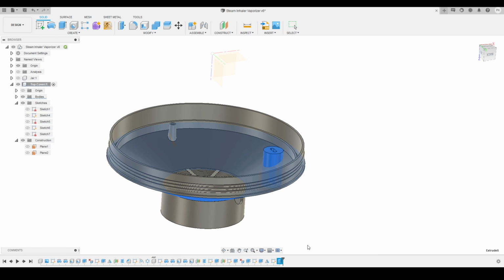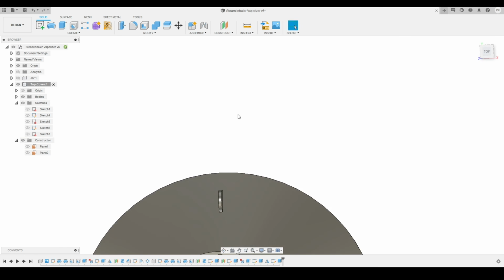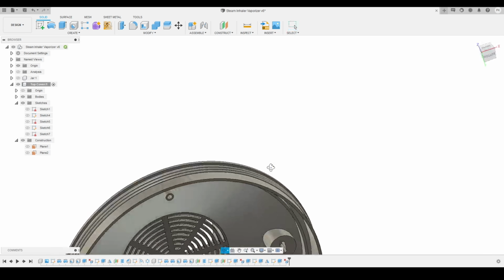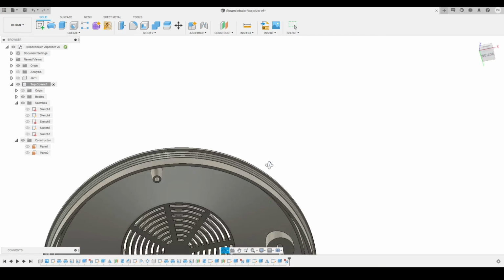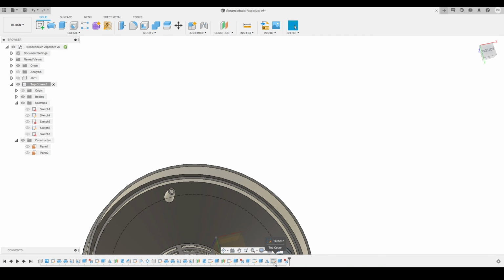So you can see this piece has been created as a new body, but I had just changed it back to a join body. Now I don't want this profile, so I had just selected the faces and will press delete on my keyboard, and that is gone. So this is what we created on the bottom side, only that particular piece.